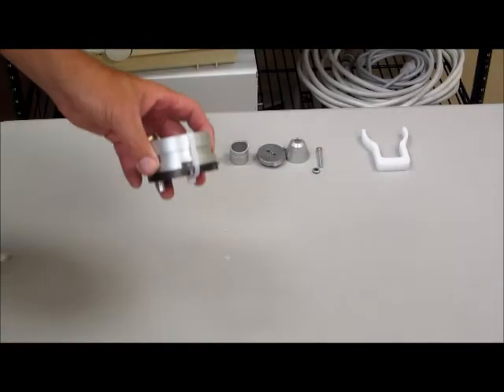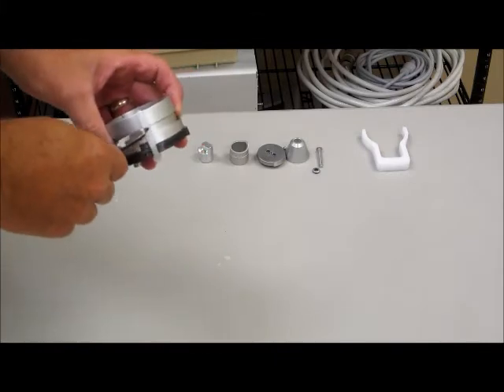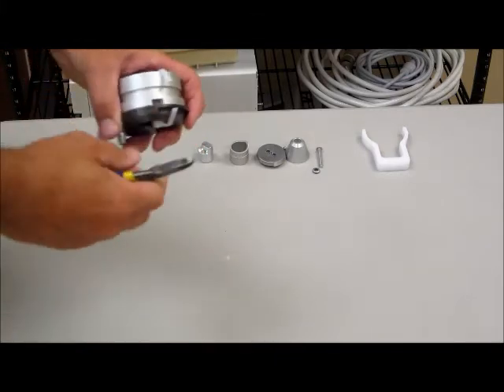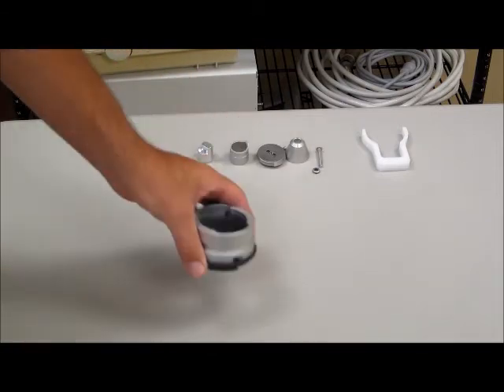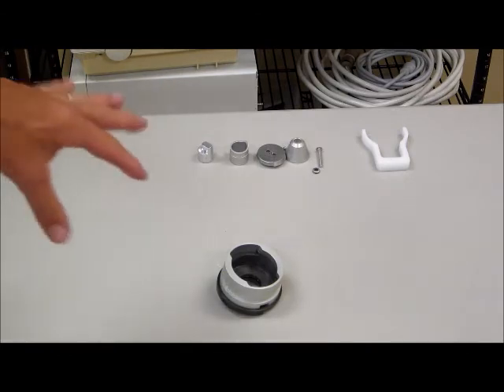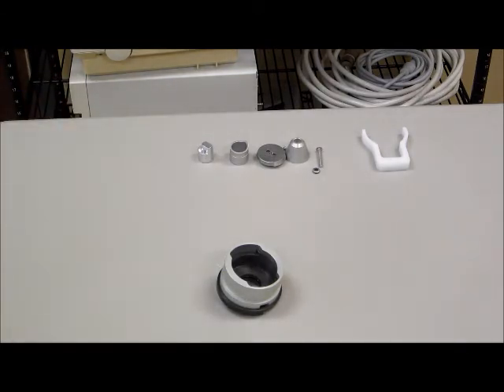Step 1 on the instructions is to remove the wire tie that was mentioned earlier. We're simply going to cut that wire tie and remove it, making sure that we're not rotating the two collars and keeping the orientation as it was before the removal of the wire tie.